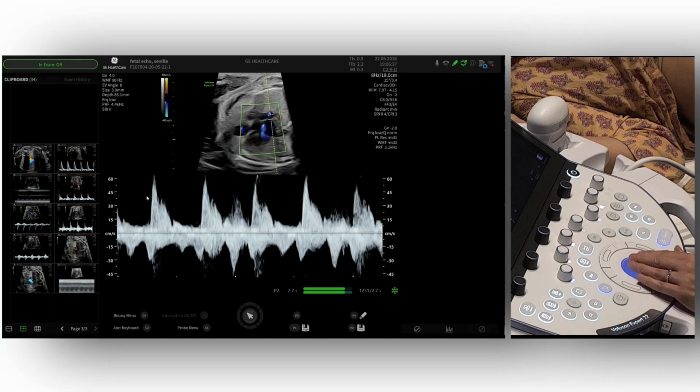So for example, here we are getting better, no? So in positive, we are getting the pulmonary artery, yes? So these peaks will reflect the ventricular contraction, and below we are getting the pulmonary vein, yes? So this notch here reflects the atrial contraction, like in the ductus venosus. In this way we also see very well. So we have this pulmonary vein, and when we have the notch it is the atrial. So this is reflecting the atrial contraction, and this is reflecting the ventricular contraction. So again, here we can see the correspondence between the atria and the ventricle, and we can measure the time periods of the AV-VA.